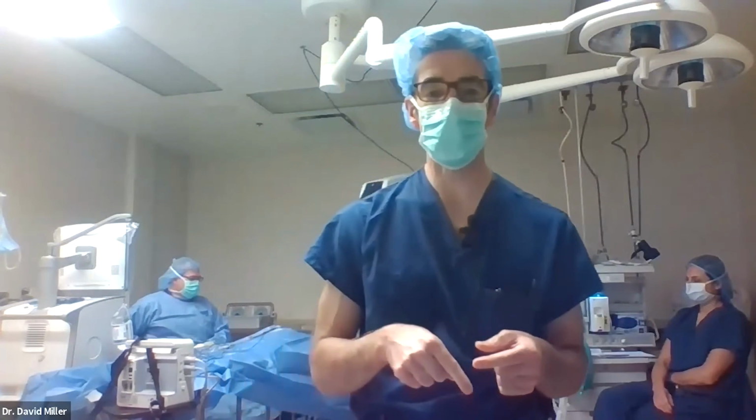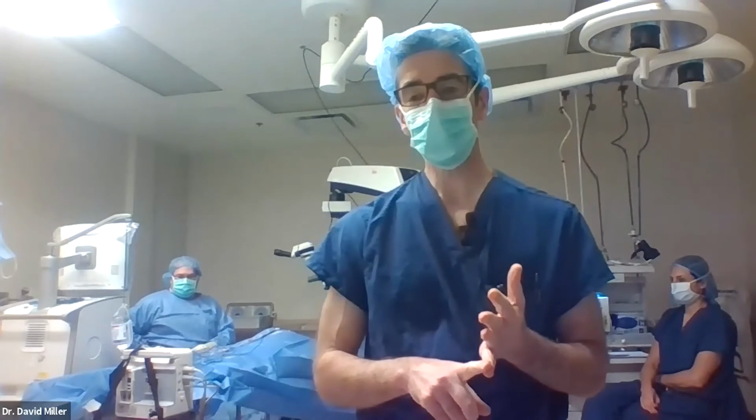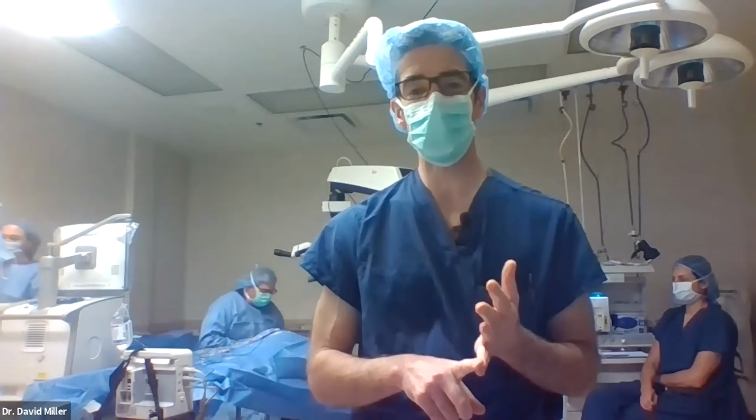Do I always perform a retinotomy? No. Sometimes we will drain through the retinal breaks or put in perfluorocarbon liquids to press the fluid out to the anterior breaks. You can put in these heavier-than-water fluids and it will press the fluid out. Those can be nice, but with the perfluorocarbon fluids, you then have to drain that under air-fluid exchange. And it's an oil, and you can leave behind small droplets of oil or something like that. Again, it's an extra step.